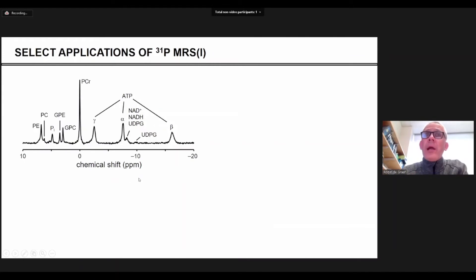Now you're not limited to just proton MRS, you can also do phosphorus MRS. This is a typical phosphorus MR spectrum, looking at ATP, phosphocreatine, and other information you can get is related to the intra- and extracellular pH, based on the shift of this peak, the inorganic phosphate. You can also get fluxes through the creatine kinase system or ATP synthesis. And a bunch of peaks right over there are related to the redox potential.